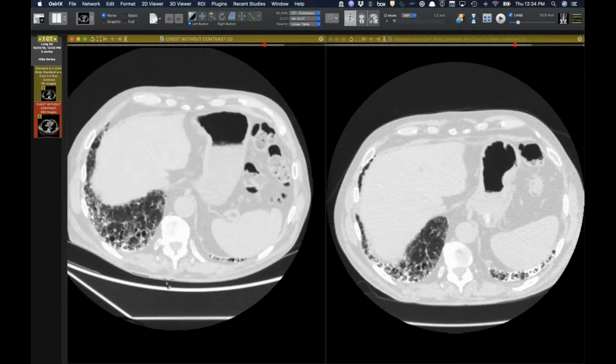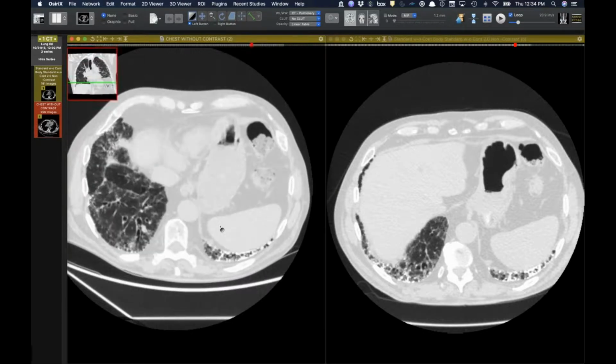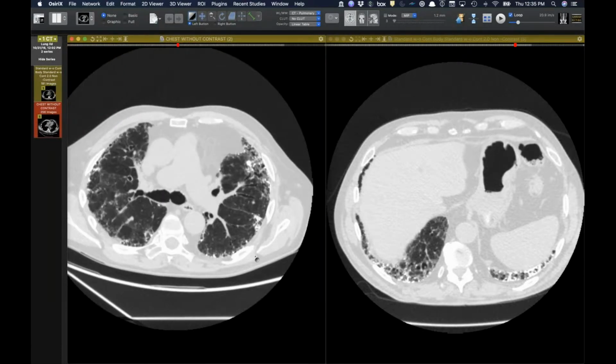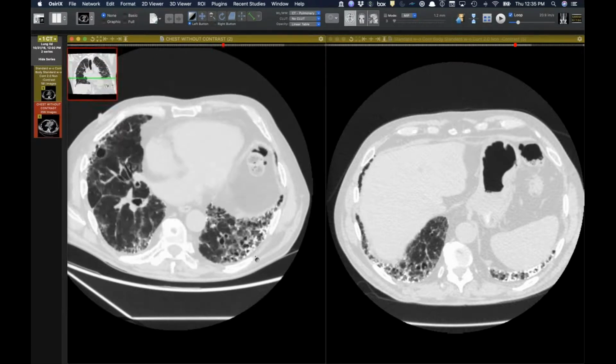Because I know we keep mentioning that amyloid is in the differential, but certainly if it really is in the differential for a look like this, then that would have significant implications for the patient, right? As opposed to just dendriform ossification. Have we seen cases that look like this that are amyloid?